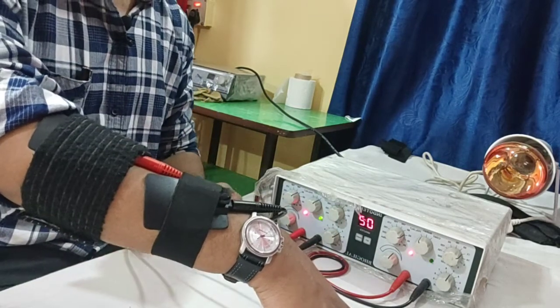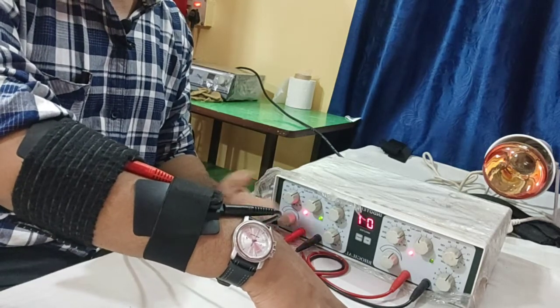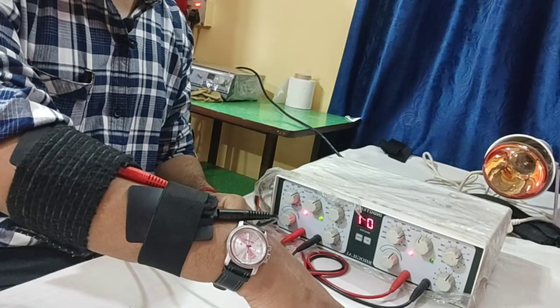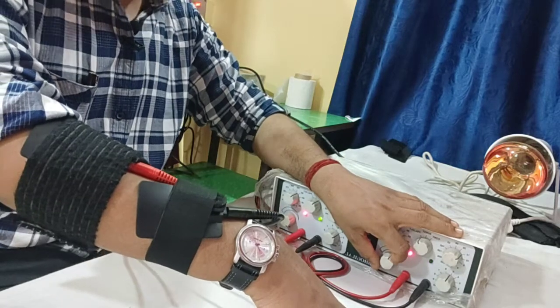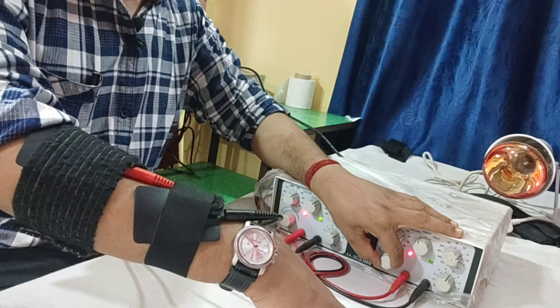And whenever a patient comes with chronic osteoarthritis or chronic joint pain, wherever the sensation of the particular joint area is diminished, that is the time we will be using this polarity alteration or the modulated TENS, and the duration for the modulated TENS is supposed to be 20 to 22 minutes.